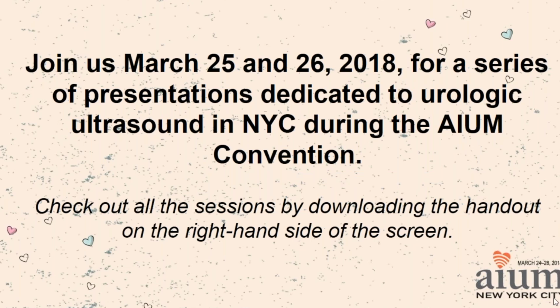This examination will rule out only, it doesn't rule out other causes, like the test doesn't identify neurologic causes of erectile dysfunction. This is only looking at vascular, and it will to some degree identify corporal problems, meaning smooth muscle problems and tunica albuginea problems. So it does not usually identify anything that's neurologic.